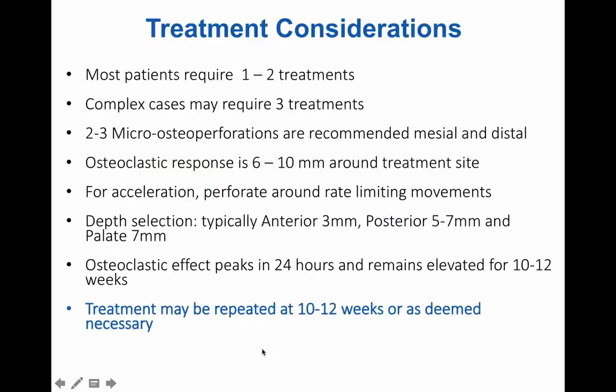So here are some considerations when you are evaluating a patient for a case. Most patients will require 1 to 2 treatments depending upon the complexity of the case. A complex case may require as many as 3 treatments. As far as how long the effect remains in place, if you look down toward the bottom, you'll see the osteoclastic effect peaks in 24 hours and remains elevated for 10 to 12 weeks. What that means is that the effects of the micro-osteoperforation last around 3 months or so.